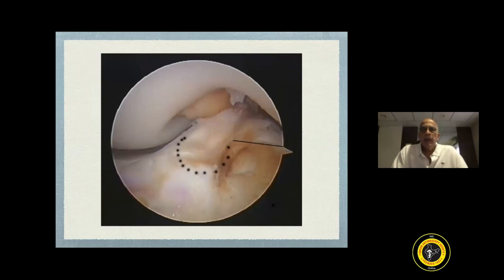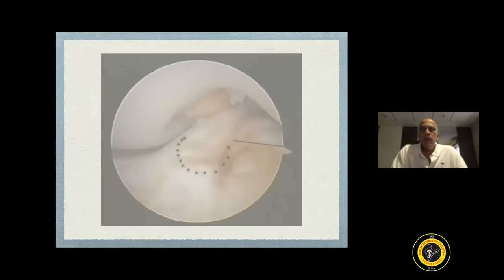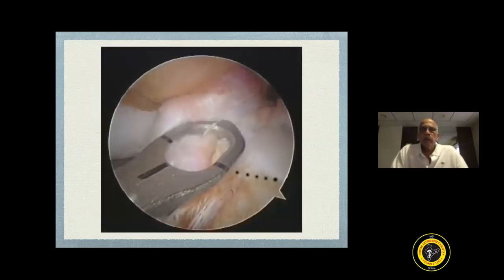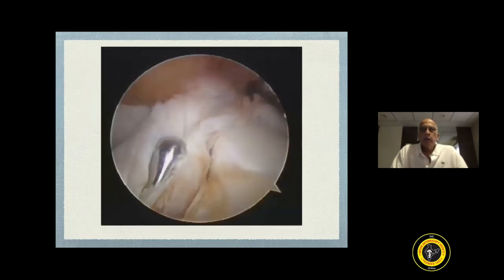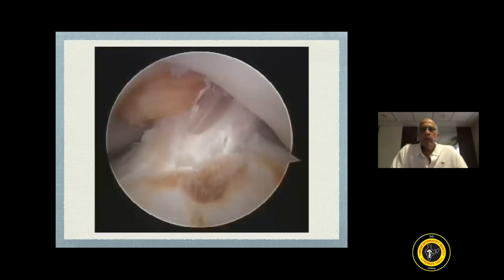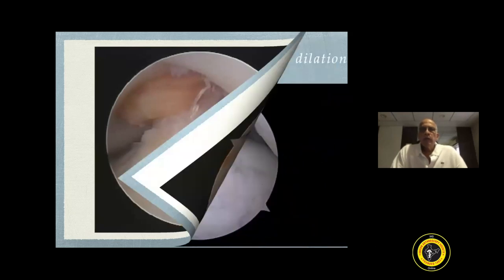You can identify the tibial footprint, then pass a jig which is almost like a footprint jig. The horizontal lines on the jig are in line with the posterior margin of the lateral meniscus anterior horn, and the vertical lines give you the trajectory of the ACL graft. The k-wire is then passed in the right direction, the tunnel is cleaned up before you pass the graft, and this is the final appearance after graft passage — this is an ideal positioning of the tibial tunnel.